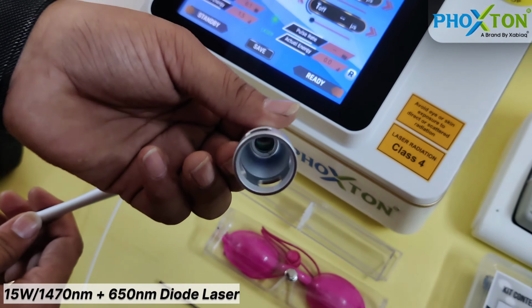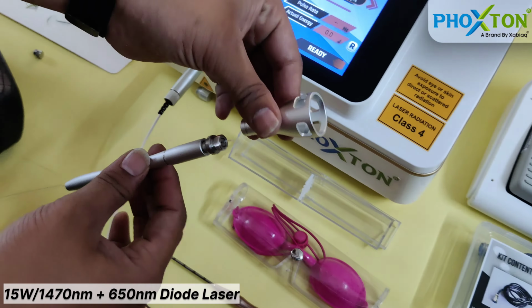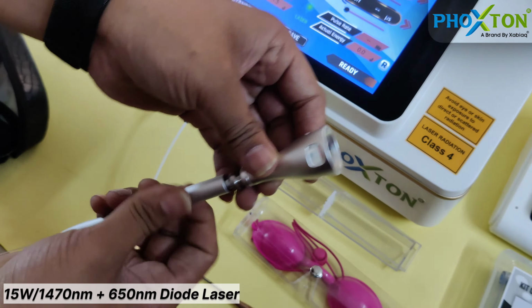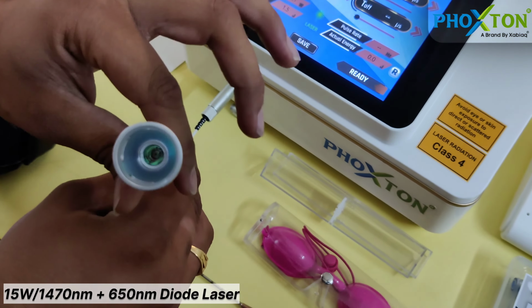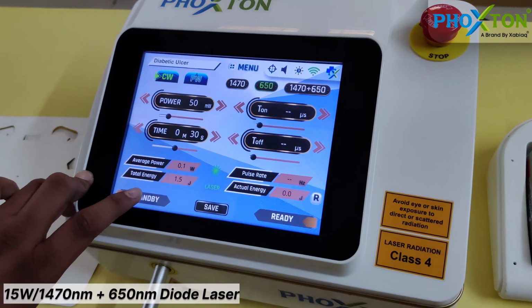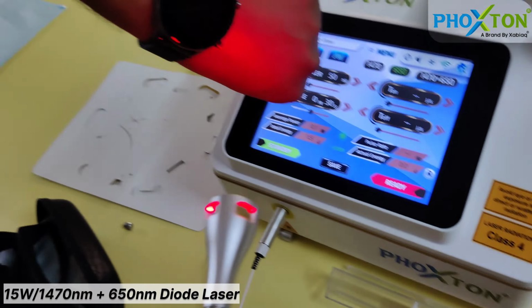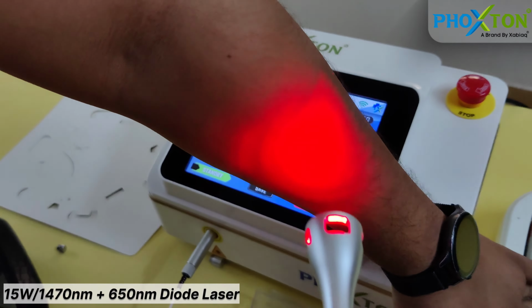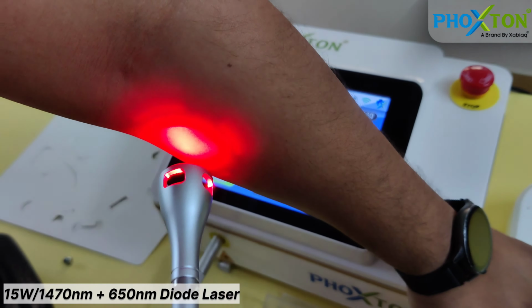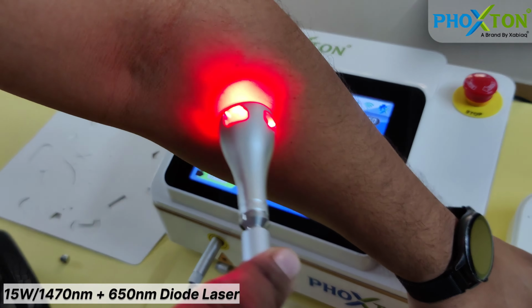Now this is the head of this fiber. We will be unscrewing the backside screw. Sorry, you can attach this tip on this head. So I am attaching this. So here is how it will look. Now whenever I press standby and ready, the fiber is ready to fire. Whenever I switch on the laser emission, this is how the therapy is given to the patient.